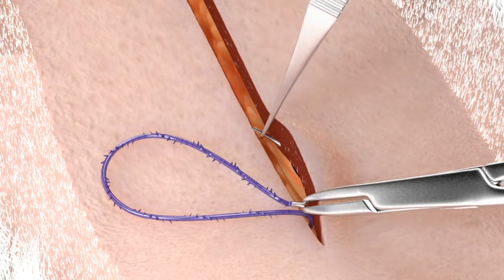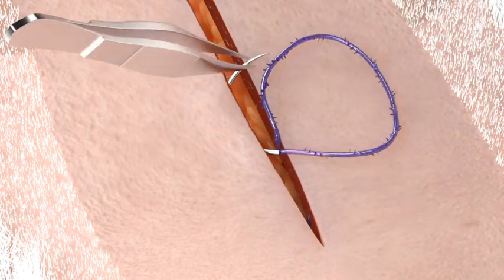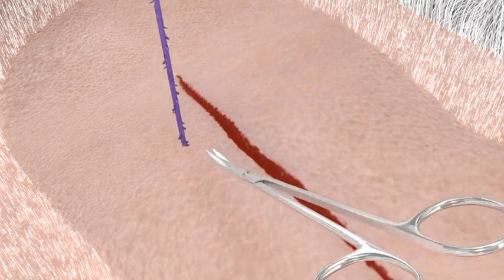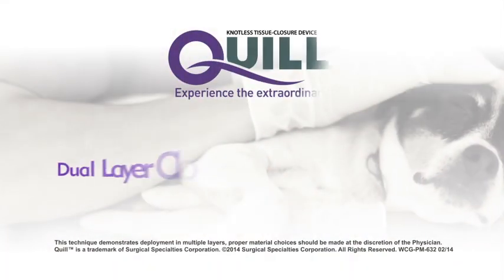Finish the superficial layer closure with the Quill device. Once the apex of the wound is reached, exit lateral to the wound again and cut the remaining Quill device flush with the skin.